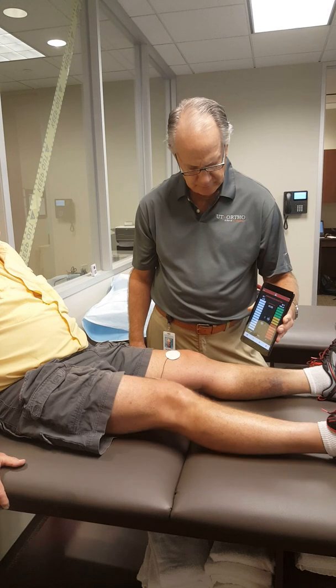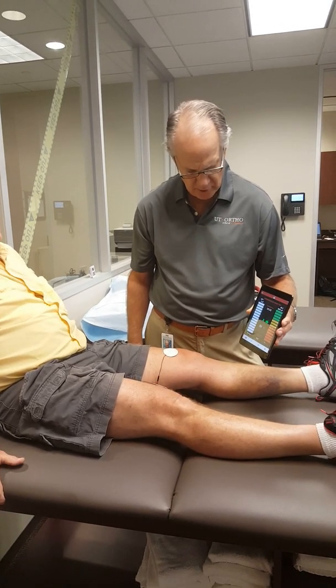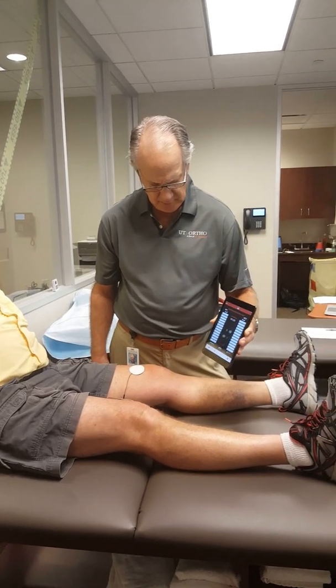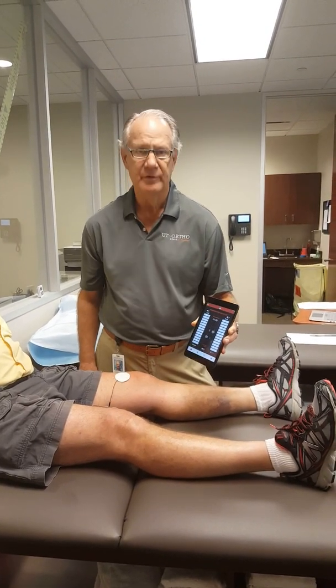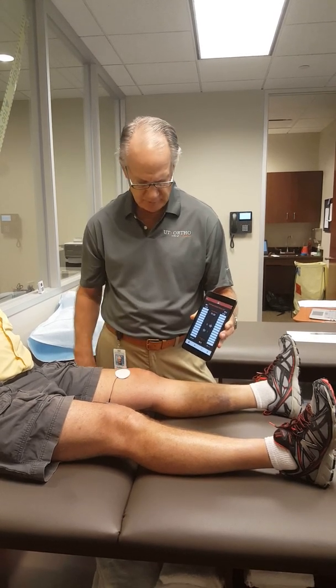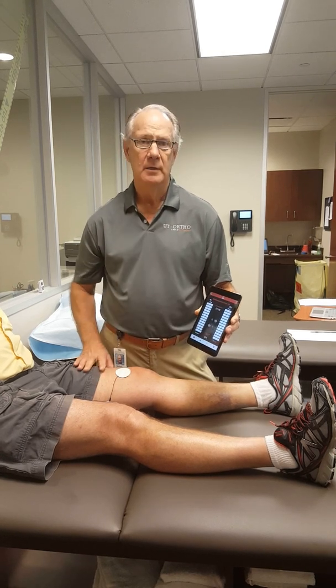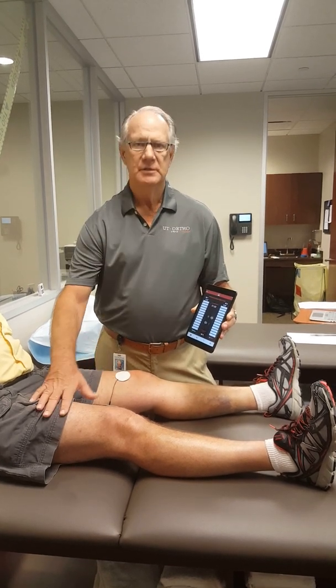And the last one — squeeze as hard as you can, hard, hard, hard, and relax. So he's got a 45% deficit, which is really good for two weeks post-op. He had arthroscopic debridement of his knee. This is a way for you to objectify what the electrical system is doing.